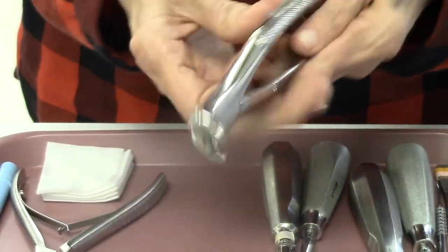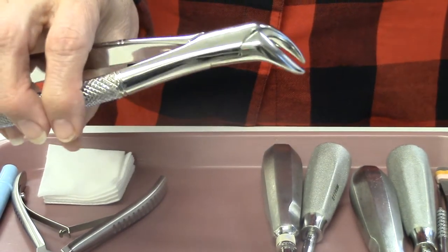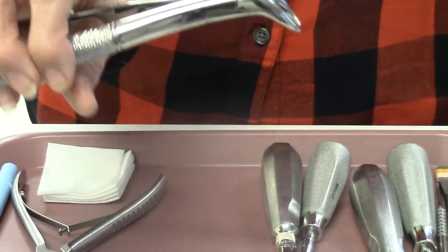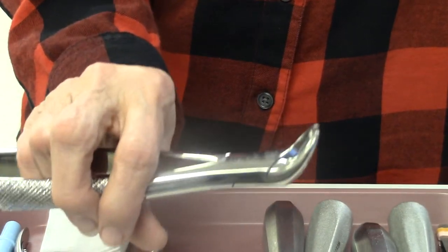This is one of our forceps. It is normally used on the mandibular, but it can also be used on the maxillary. This is called the cowhorn.